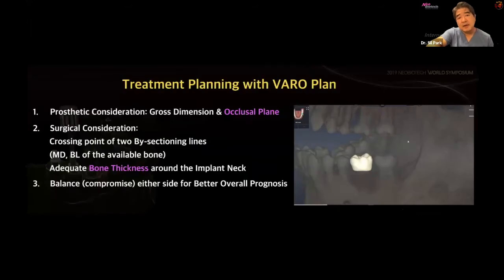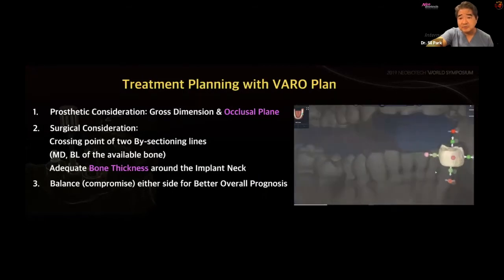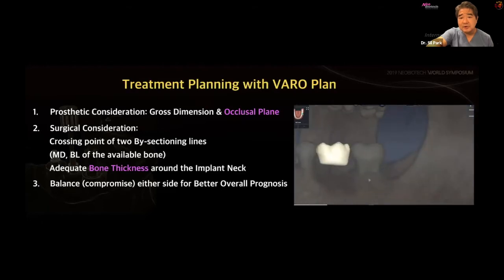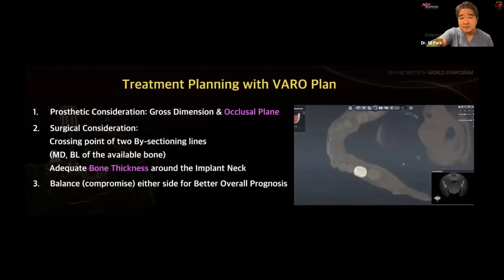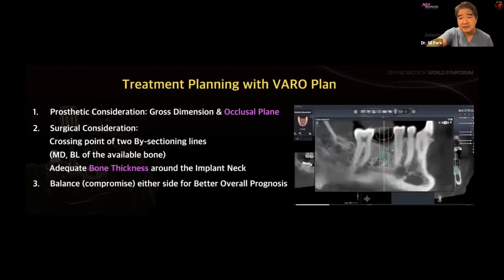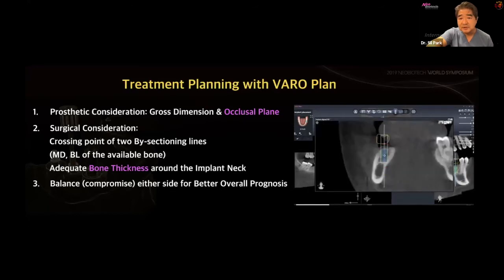And also, while you are doing the planning, one easy way is, if you do a posterior single implant case, you can simplify your prosthetic procedure too. I showed this last time too. Then basically the software is going to give you tools over there automatically. Then you're going to look at the occlusal plane, right? Curve of Spee, curve of Wilson, and then overall position, and overall size. And based on that, you can use this software to finalize your implant position like that.